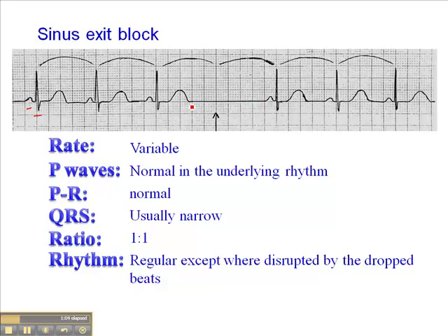The big difference here, though, is that if you look at the R-to-R interval, there's a pause. Something happens here that's different. First and foremost, there's only one dropped beat. And then the next beat falls exactly into sequence, exactly into sequence from the underlying rhythm.